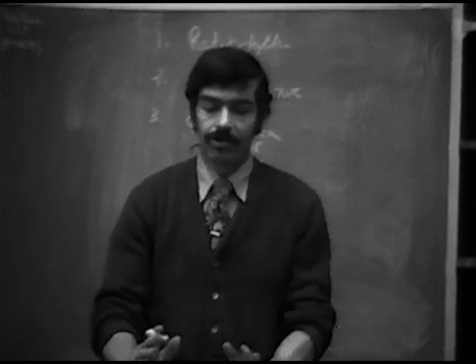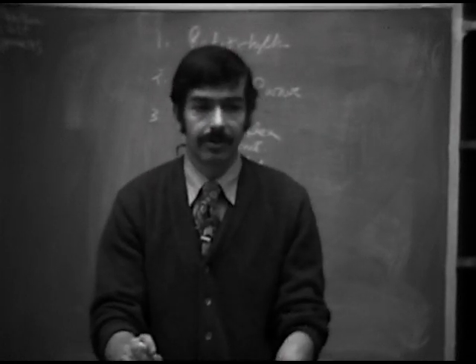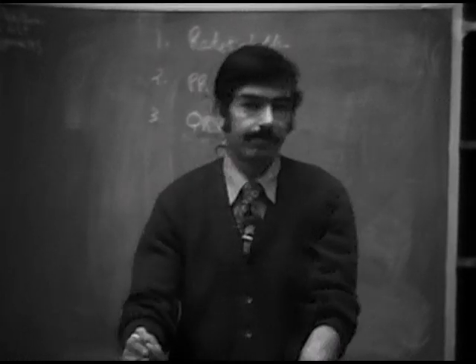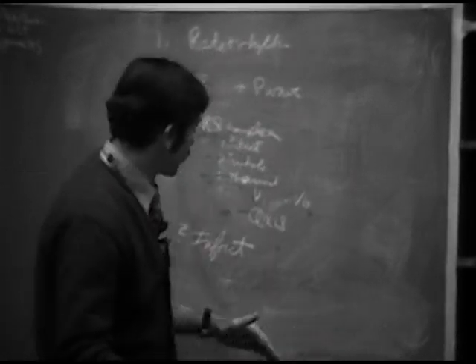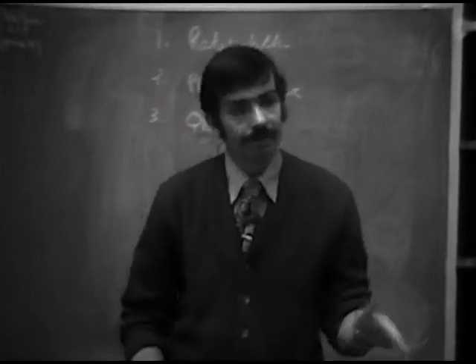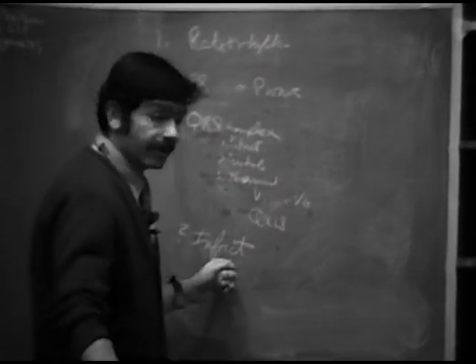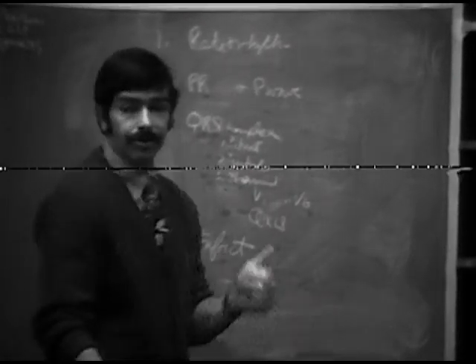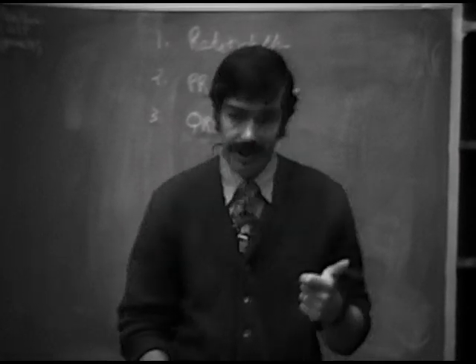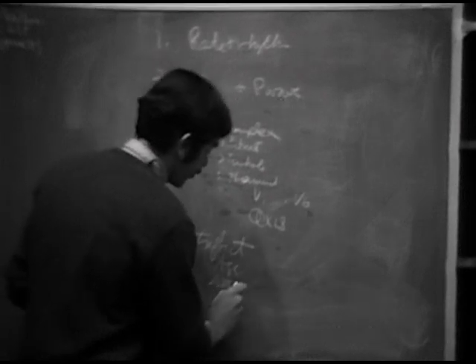If there's no significant Q waves, you look at the horizontal plane and you look at the R wave progression. R wave progression should proceed in a smooth, normal fashion, as we previously described. If there are no evidences of an infarct based on the lack of Q waves or normal R wave progression, then you go on to the next step. But if you do see an infarct, you want to know two things about it, which are what? Location and age. Age and location.